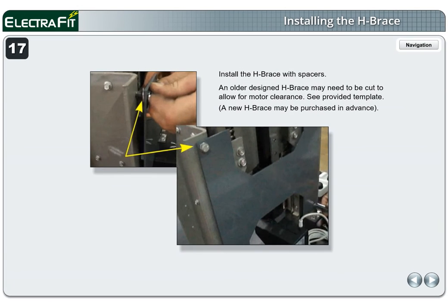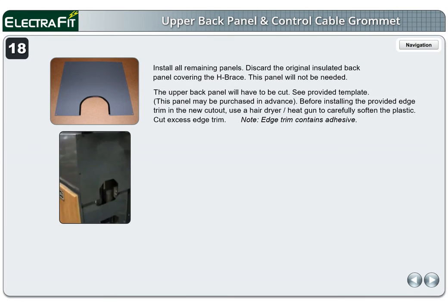Page 17. Install the H-brace with spacers. An older designed H-brace may need to be cut to allow for motor clearance — see the provided template. A new H-brace may be purchased in advance. Install upholstery and clean the upholstery with window cleaner. Page 18. Install all remaining panels. Discard the original insulated back panel covering the H-brace — this panel will not be needed. The upper back panel will have to be cut; see the provided template.